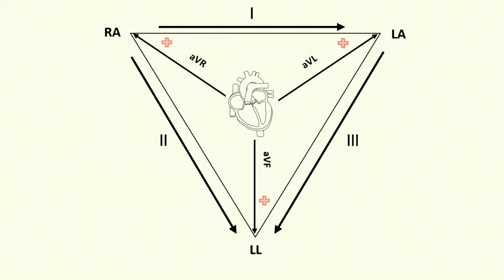How do you establish these? Yeah, it's a really good question. So what I would tell you is that remember that what you're really measuring the potential across is the heart, which is in the center of the chest. So if you moved the electrode from the right arm, from the wrist to the shoulder, it's not going to look that different because the perspective of that looking at the heart is pretty similar. And you can even move it into the chest a little bit, and it's not going to look that different.